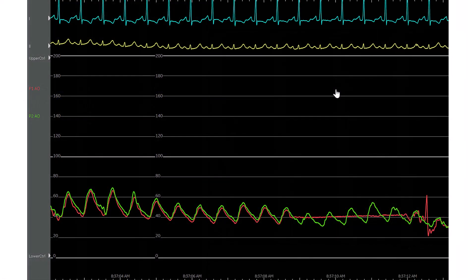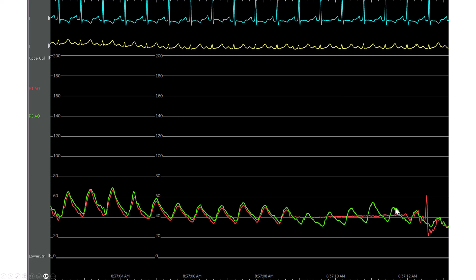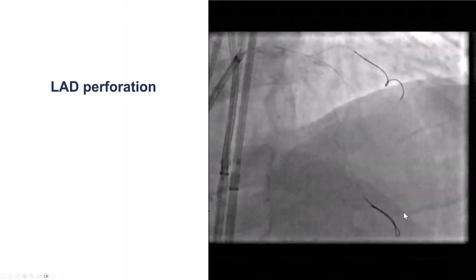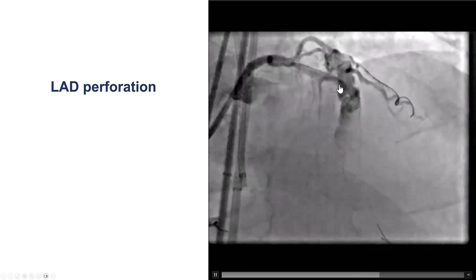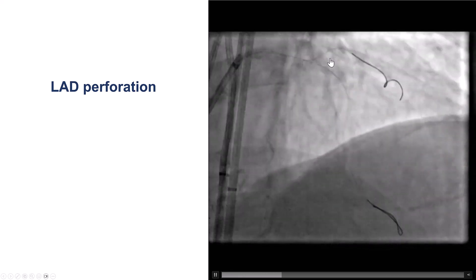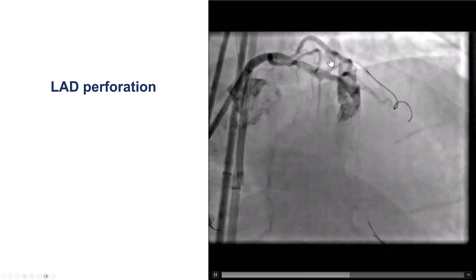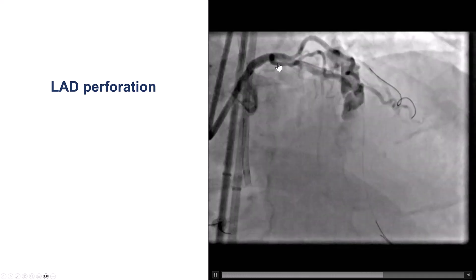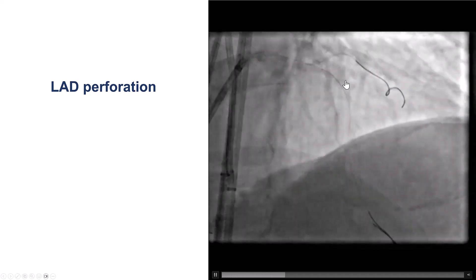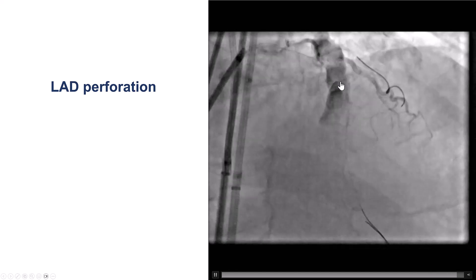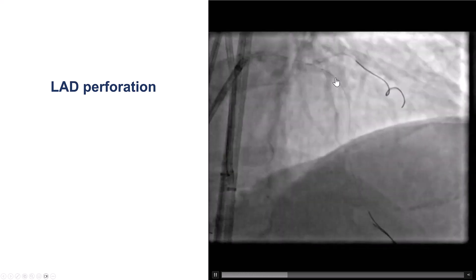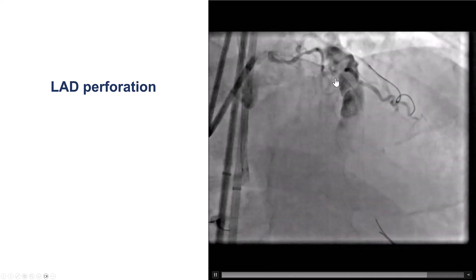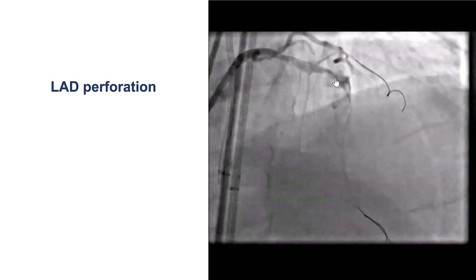Shortly afterwards, the patient started dropping his blood pressure. He has a pretty large perforation. Interestingly, the perforation is not at the area of the CTO but further distally, and was likely caused by the post-dilatation balloon. This corresponds with the area of eccentric calcium seen on the coronary CT.